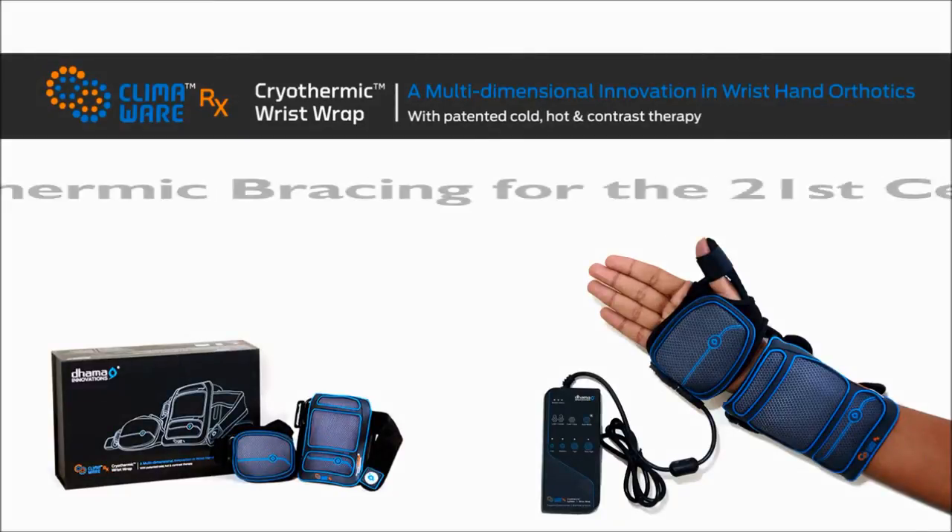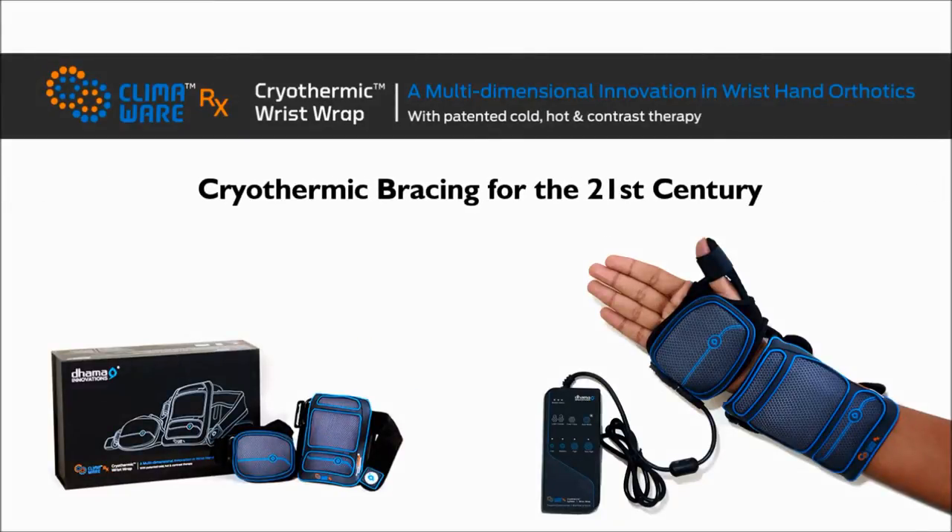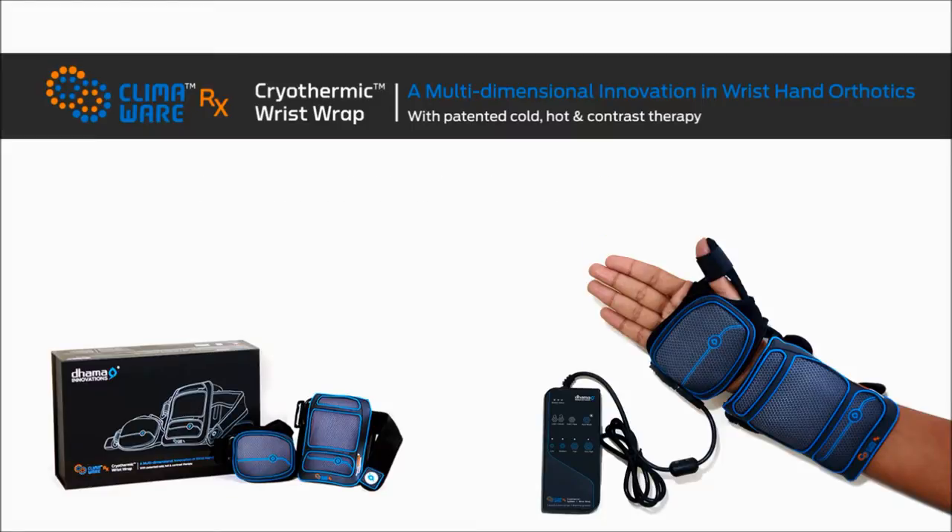Presenting the cryothermic bracing for the 21st century. The new Climaware RX cryothermic wrist wrap by Dama Innovations is an advanced multi-dimensional wrist hand orthosis intended to decrease pain symptoms associated with various wrist injuries and surgery, and to improve wrist joint function.